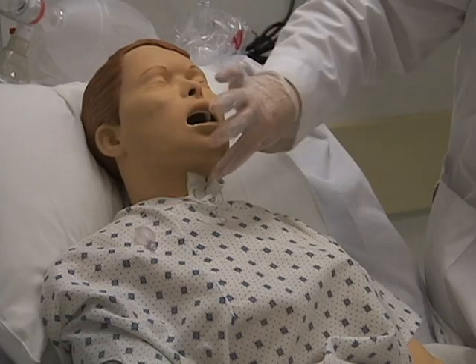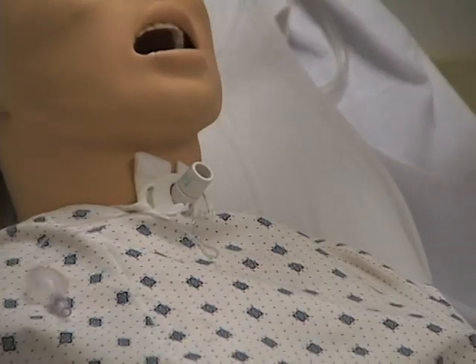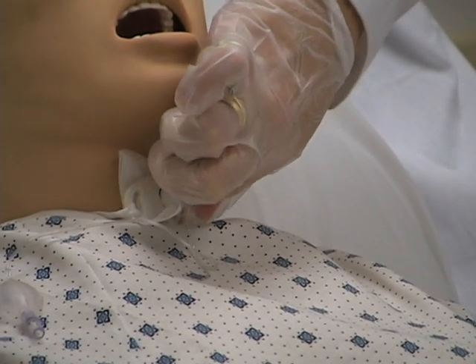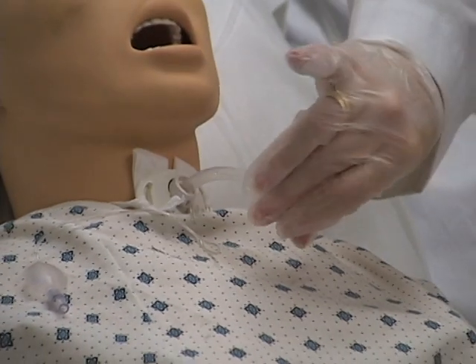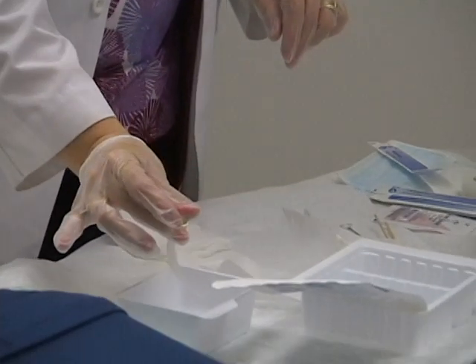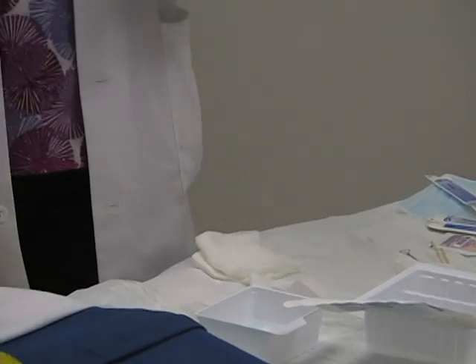When you look at the tracheostomy, you're going to see that there's a little blue dot that lets you know it's locked. You're going to turn the lock counter-clockwise one quarter turn. You're going to lift out the cannula, taking it and dropping it into your peroxide and saline solution. You're going to let that soak for a minute or two.